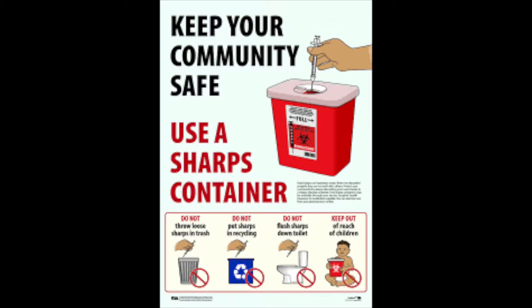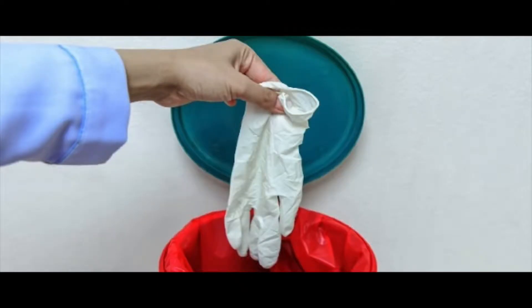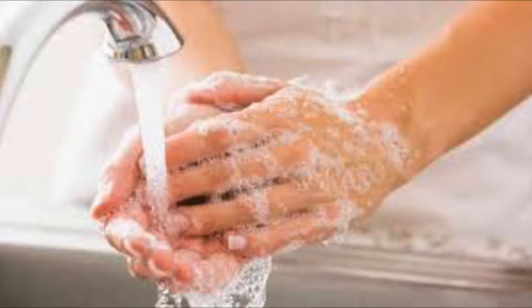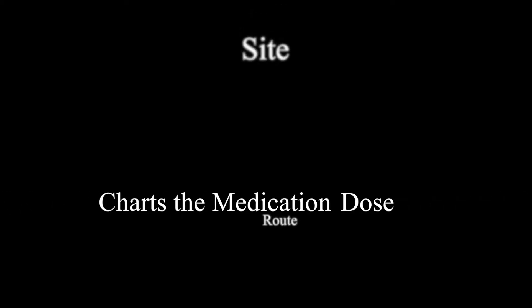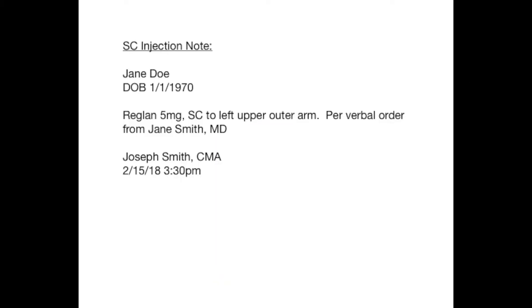The medical assistant safely discards the needle and syringe in a sharps container without recapping the needle. He or she then removes and disposes of gloves and appropriately washes and sanitizes hands. The medical assistant correctly charts the medication, dose, route, site, and patient response. For example: Ms. Jane Doe received Reglan 5 mg by sub-Q injection to left upper outer arm. It was uneventful and well tolerated. Joseph Smith, CMA, 2-15-2018, 3:30 p.m.